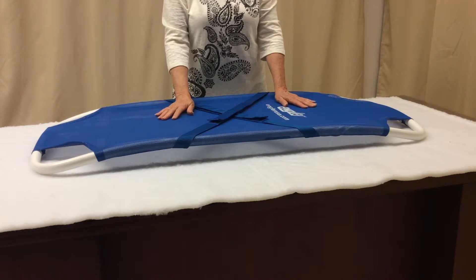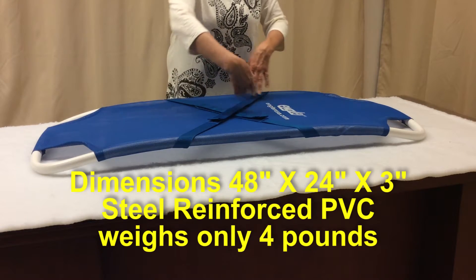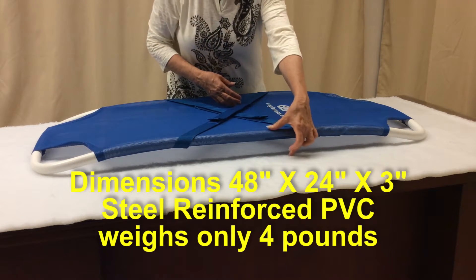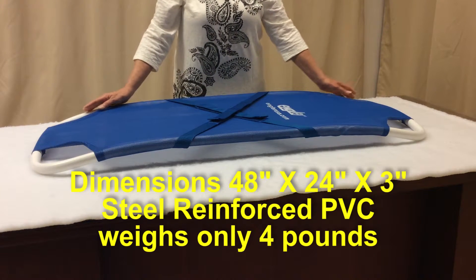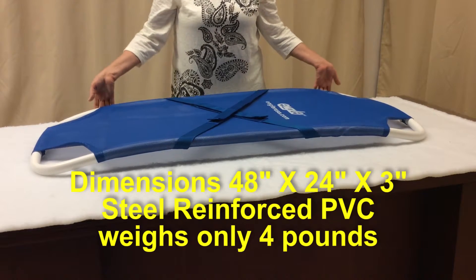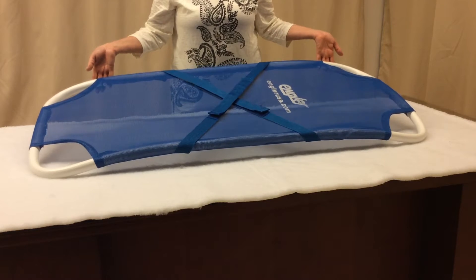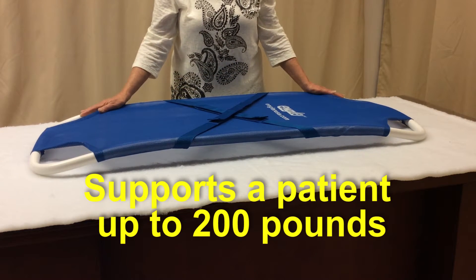The dimensions of this unique design are 48 inches long, 24 wide, and 3 inches high. Although it is made out of steel reinforced PVC material, it is lightweight at a mere 4 pounds, and you can support a patient weighing up to 200 pounds.